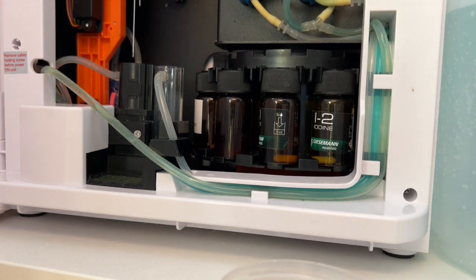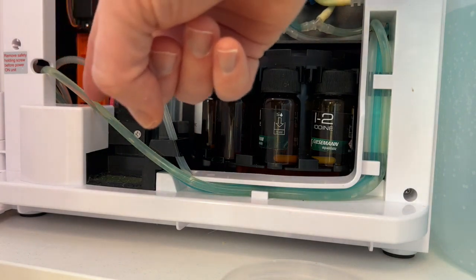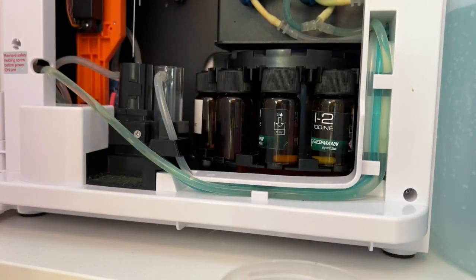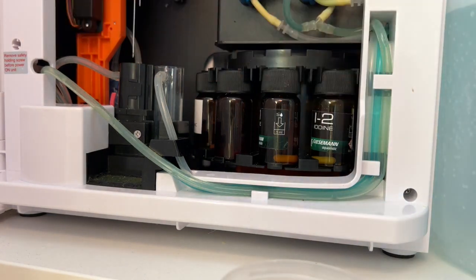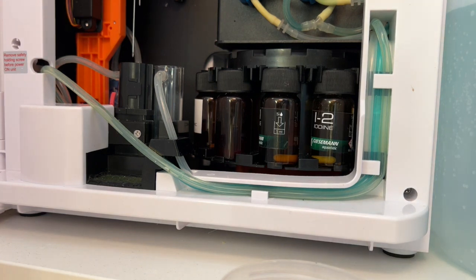Now it will empty again. You can see the empty motor restarting and emptying, and you will soon see air bubbles again. When you hear the stepper start for the third time, just observe and do nothing.